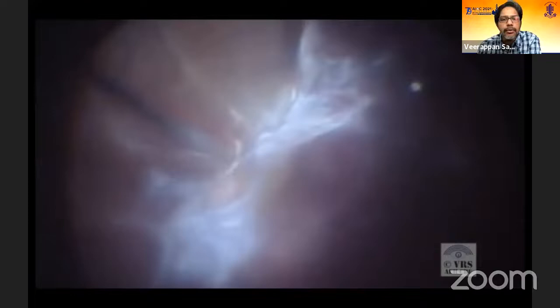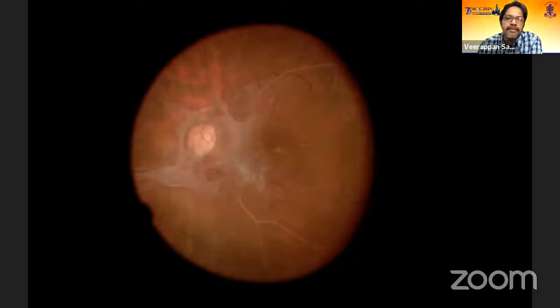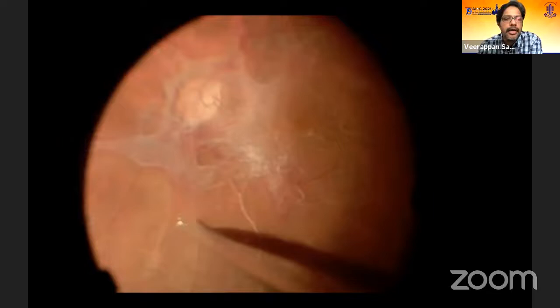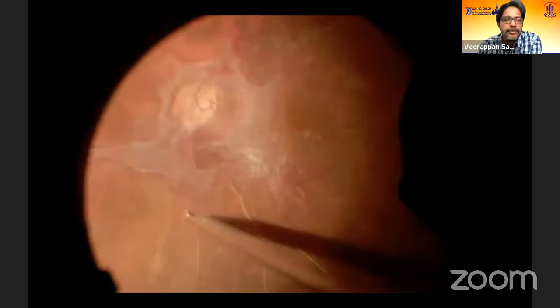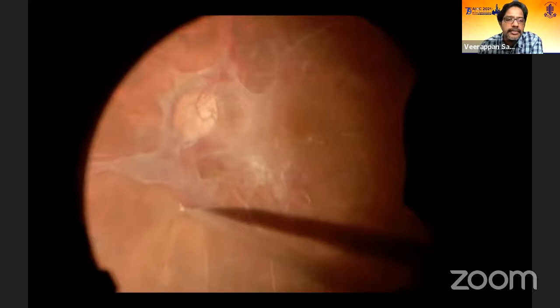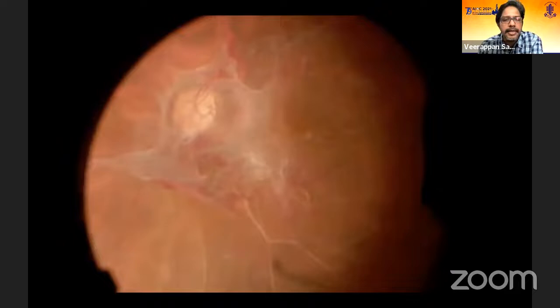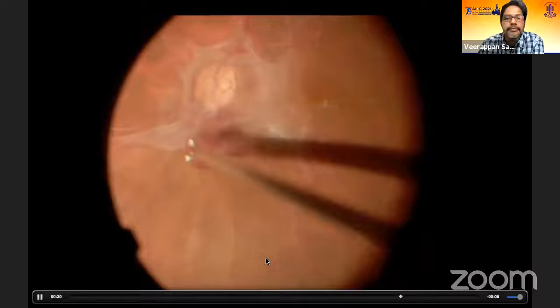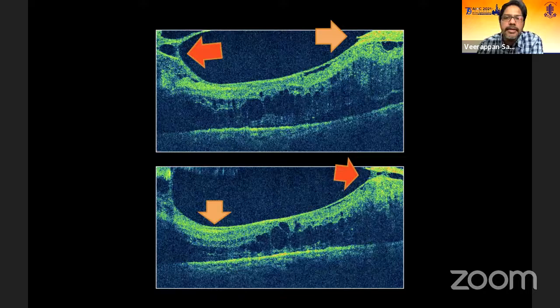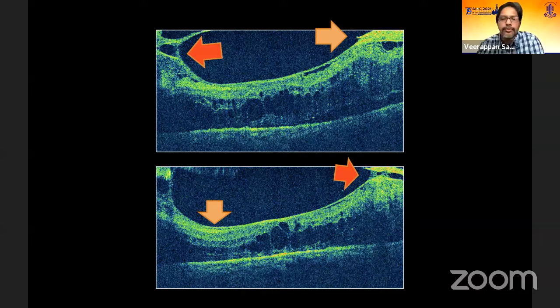In cases with loose membranes, suction alone is enough to lift the second membrane. But in cases where the adhesion is much flatter, tougher, and stronger, you have to use sharp instruments as I showed in the first case. I usually use the 27-gauge bent needle — the type dental surgeons use for gum anesthesia. Once you lift that transparent membrane, that's your surgical plane, and you can switch to your forceps and proceed with peeling. Sometimes the membranes run from arcade to arcade — as shown in this vertical scan — and failing to recognize this on the table can lead to late-onset complications.